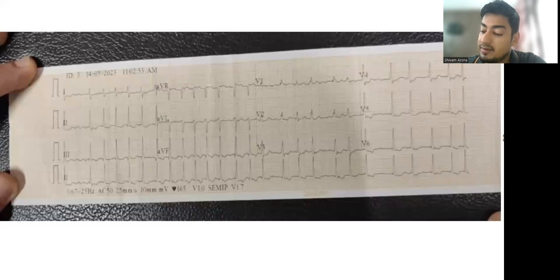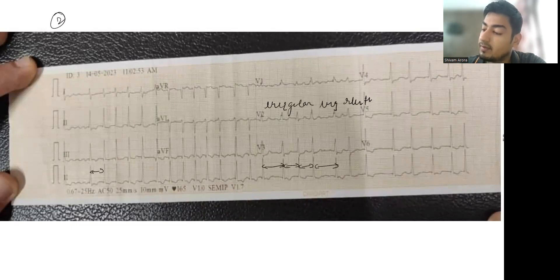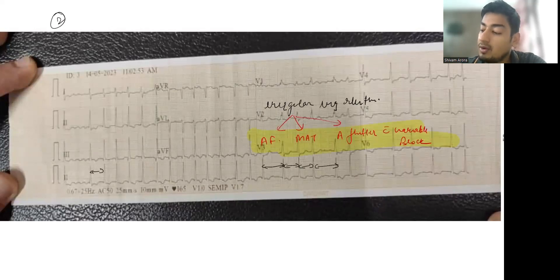This is the second ECG. In this ECG, the RR interval is irregular — this is an irregularly irregular rhythm. The differentials of an irregularly irregular rhythm are atrial fibrillation, multifocal atrial tachycardia, and atrial flutter with variable AV block.